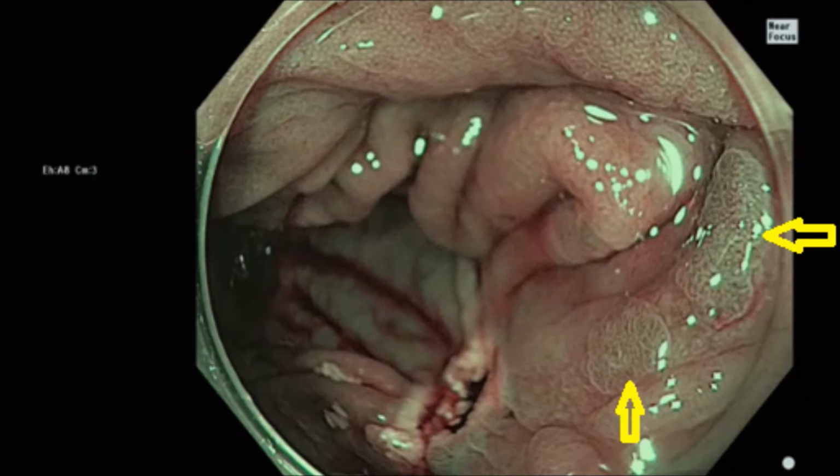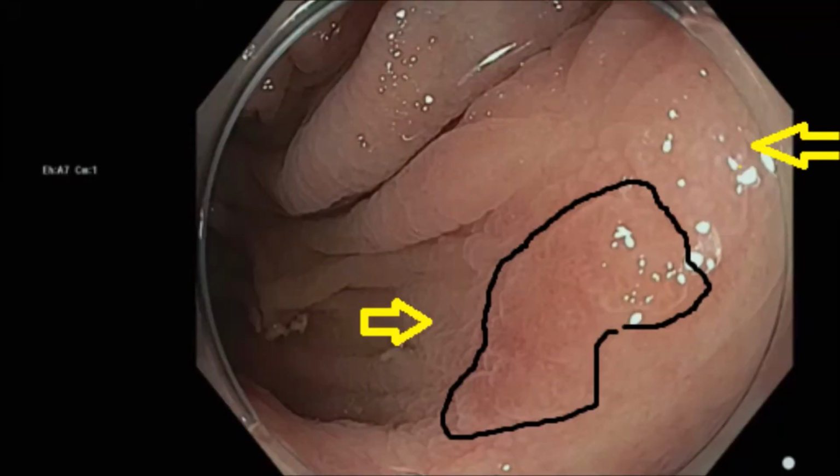So these arrows are on discrete nodules. You can see that both of them have discrete borders and both of them have nice 2 pit patterns. This is the left-hand edge of the scar, and there's an area of concern. Looks a little bit red in white light, surrounded by the black line.